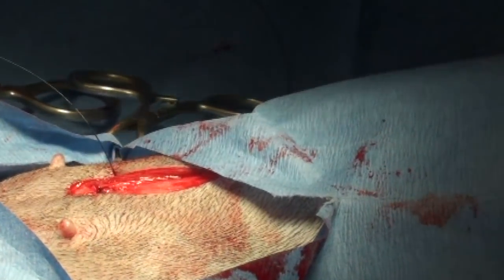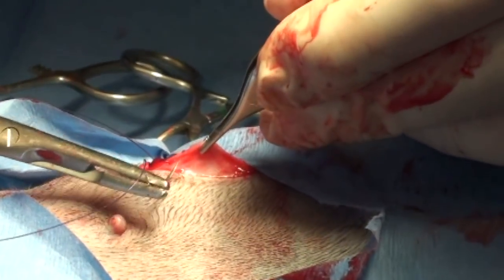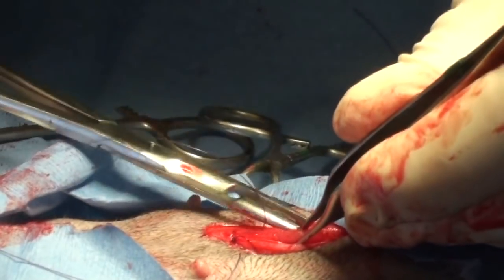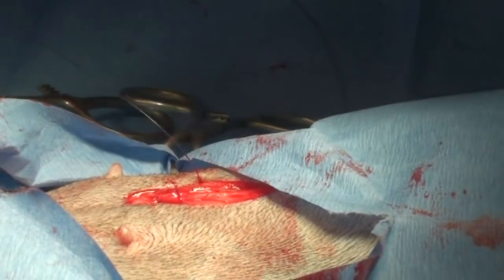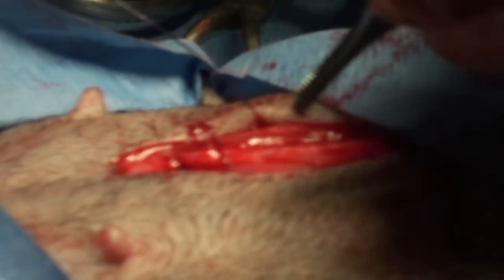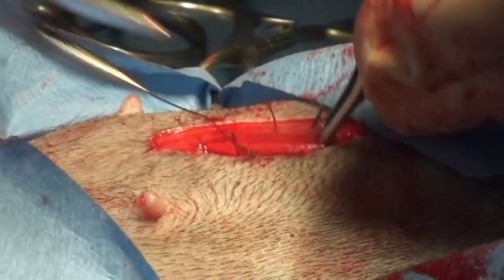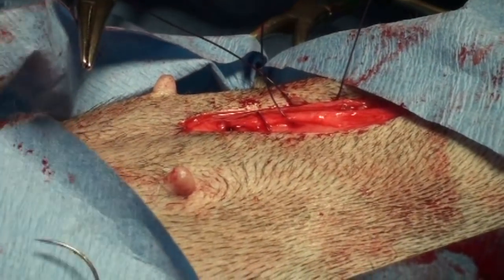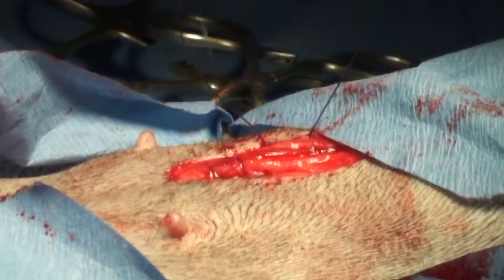We're just going to keep going through and sewing up. Get stuff out of there so you can see how that just sits in there. There's the knot and there's the suture. This is called a continuous suture. What that means is instead of individual knots, it's one continuous suture. Sometimes stuff gets tangled up and you've got to get it out of there and then pull through.